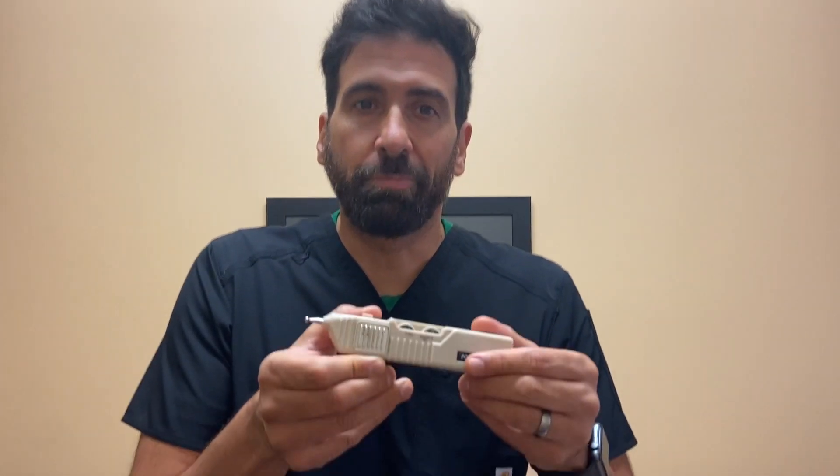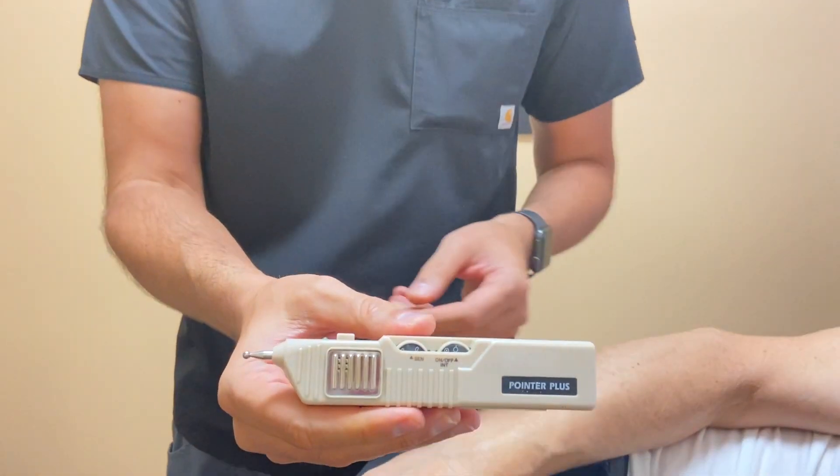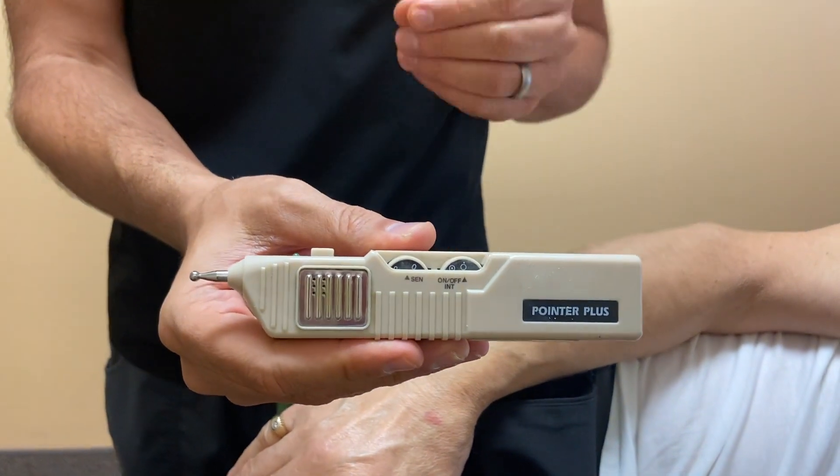Hi, this video is to teach us about how to use the pointer plus. The pointer plus is used to activate muscles that are shut off.